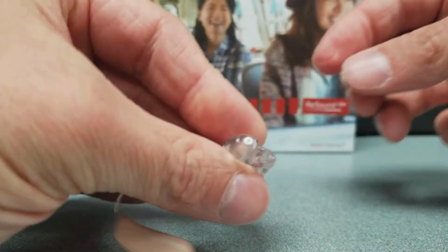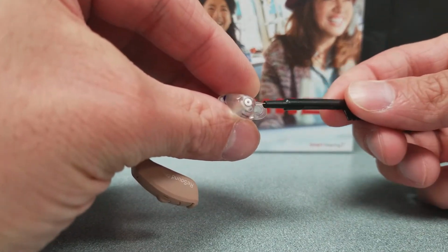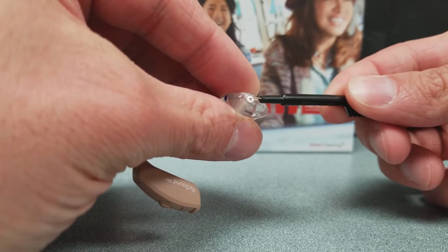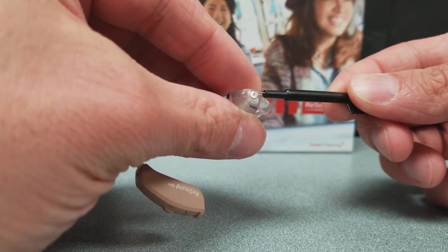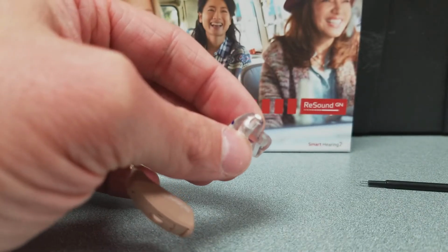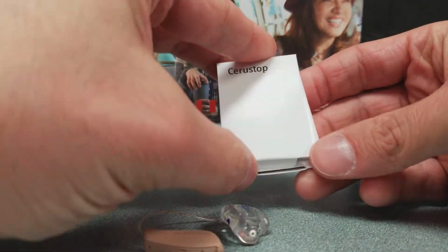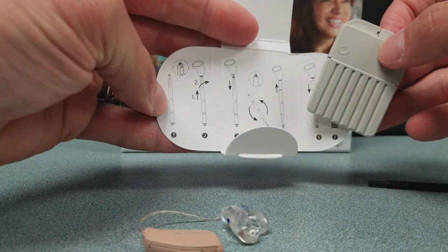On the front of the hearing aid, you're going to know a couple different things. You have this white disc. This is called a wax guard, and this is called an air vent down here. The wax guard needs to be replaced monthly, maybe a little bit earlier if you get a lot of wax buildup or cerumen. Okay. How we remove that is you have a kit that is going to look like this. You're going to open it up. You're going to see a nice little pictorial on how to remove your wax guard and replace it.